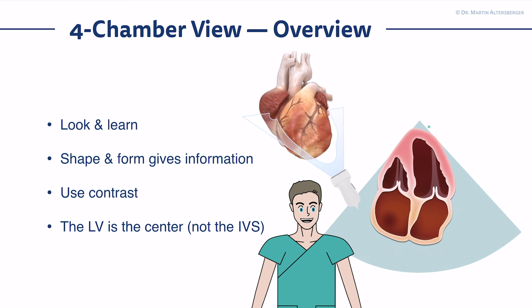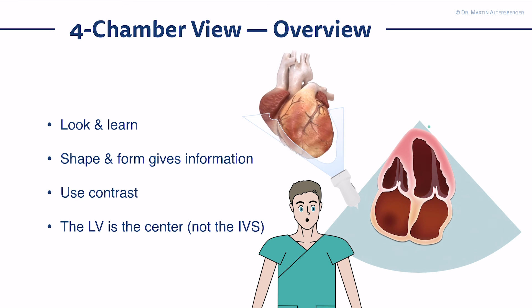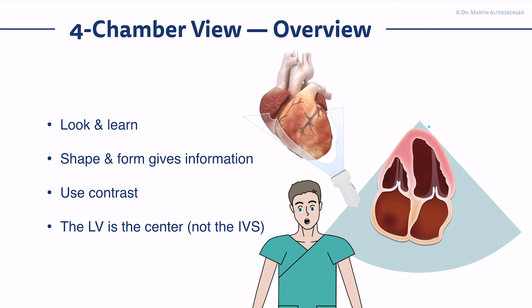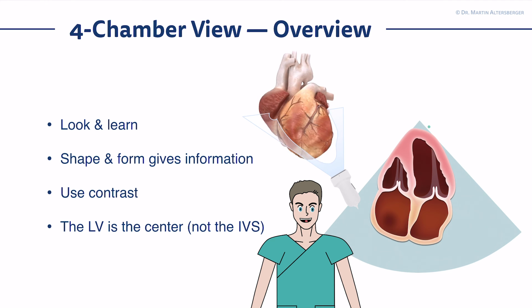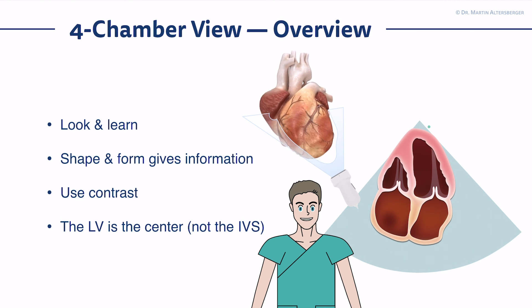Use contrast if you are not sure. Use contrast to detect aneurysms, pseudo-aneurysms, and the shape and form of the ventricle — the left ventricle — already gives away a lot of information about what the underlying pathology you're dealing with looks like.